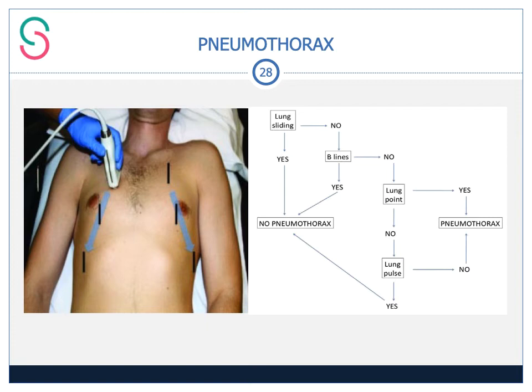There are some cases where this examination can be quite challenging. For example, when people are unconscious and perhaps hypoventilating, it can be challenging to see lungs sliding. Also, patients on ventilators, it can sometimes be more tricky to identify all the usual ultrasound features.